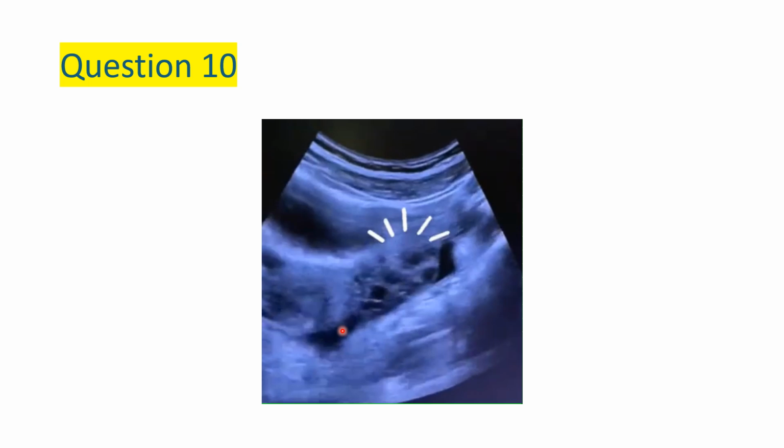So, ladies and gentlemen, this brings us to the end of our short video clip based quiz. This is very, very critical, because if you analyze these images like that, you enhance your skill of diagnosis. So don't take this lightly. This is the foundation, this is the fulcrum, this is the pith of medical ultrasound practice.